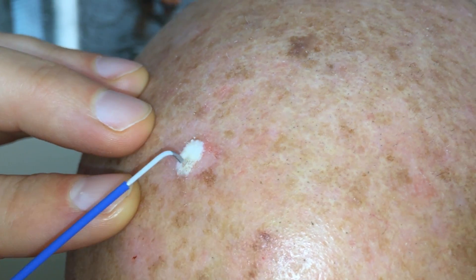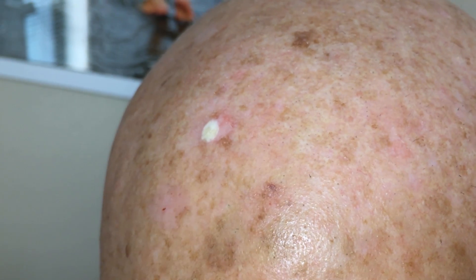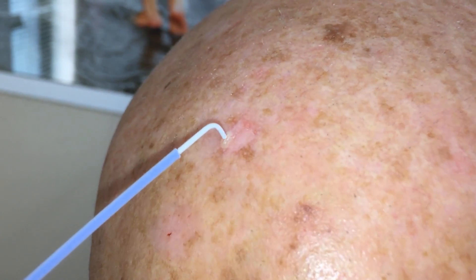That's really, really cold. We do two freeze-thaw cycles. We like to have it frozen for somewhere in the range of 10 to 20 seconds. I'd like to get a little bit longer than this, so I'm going to hit it again — sorry.